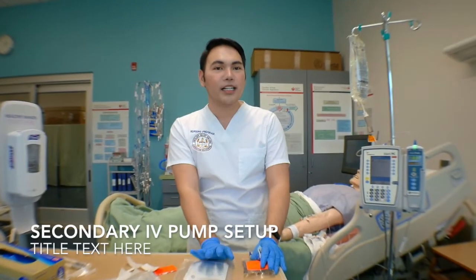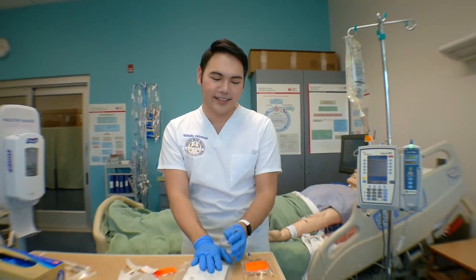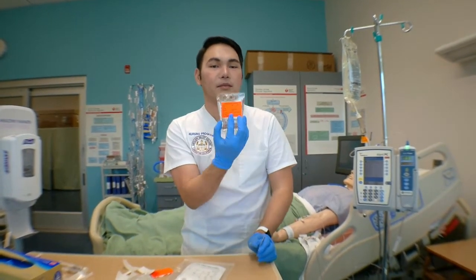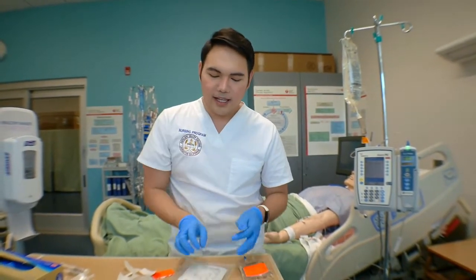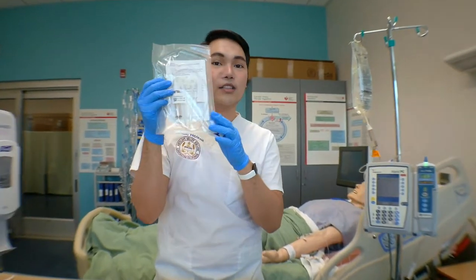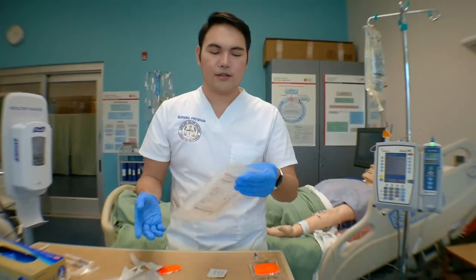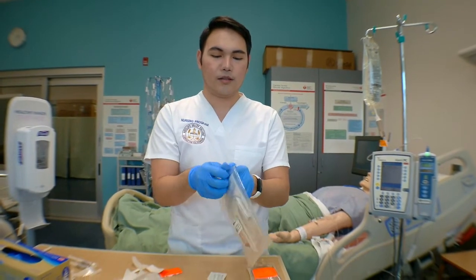Alright, so now we're done with the primary infusion. Now I'm going to show you how to do a secondary infusion. Alright, so I have my antibiotic right here. 1000 milligrams of ceftriaxone in 100 mils IV piggyback, and our secondary tubing. If you notice, it has a hanger and it's actually shorter. Alright, so I'm gonna open my secondary tubing.